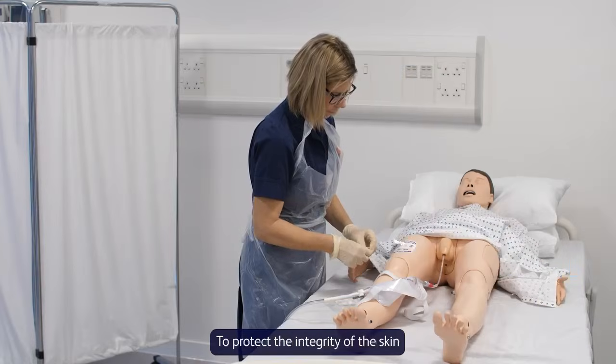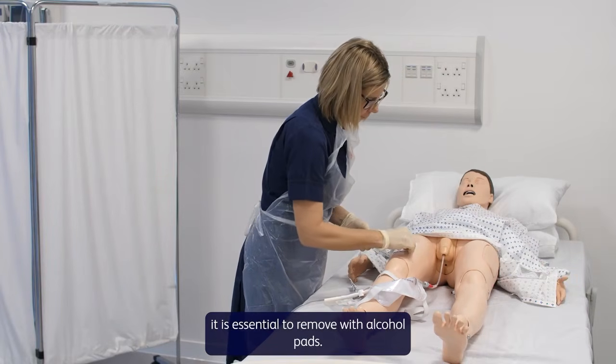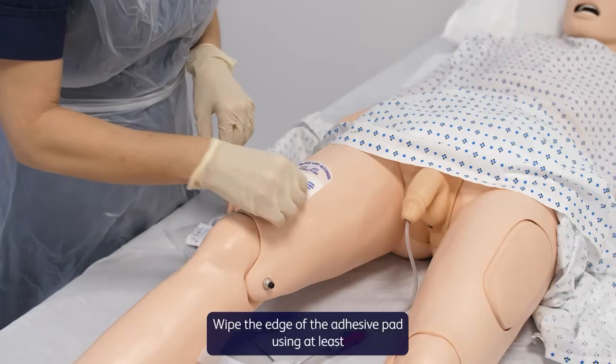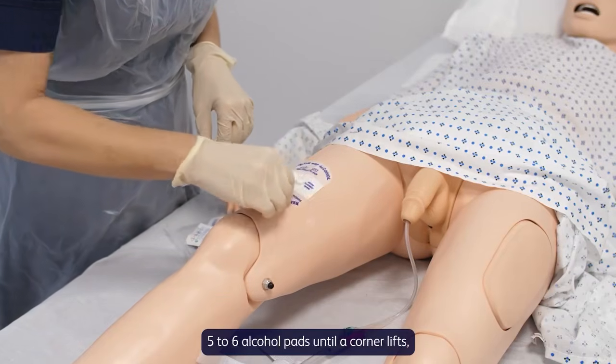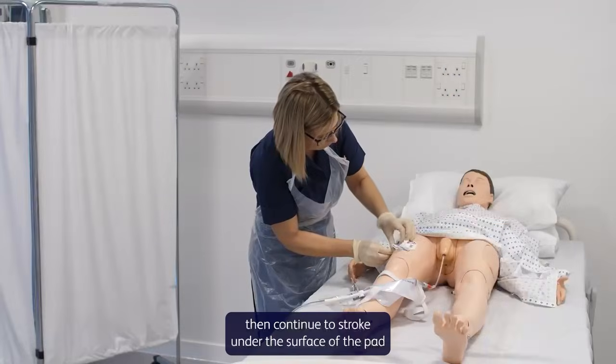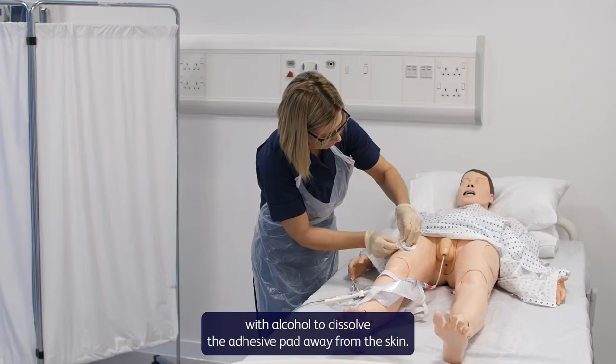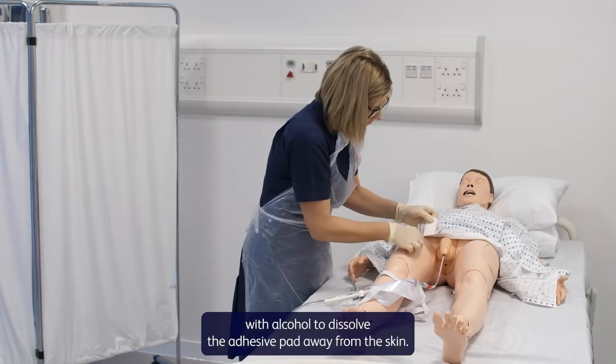To protect the integrity of the skin, it is essential to remove with alcohol pads. Wipe the edge of the adhesive pad using at least 5 to 6 alcohol pads until a corner lifts. Then continue to stroke under the surface of the pad with alcohol to dissolve the adhesive pad away from the skin.